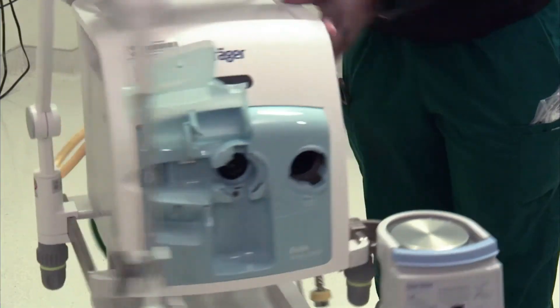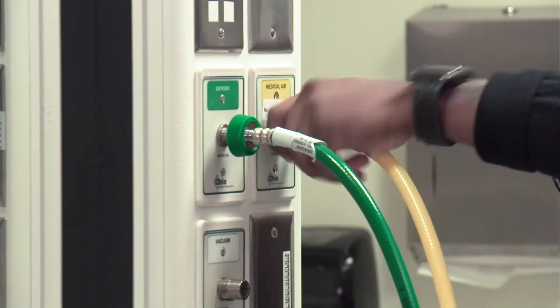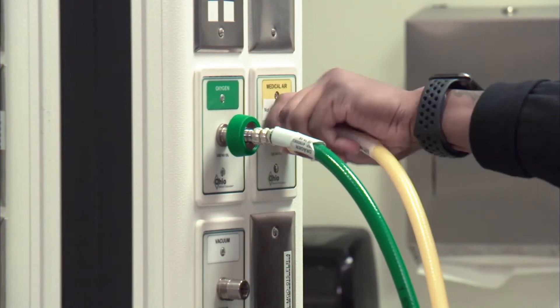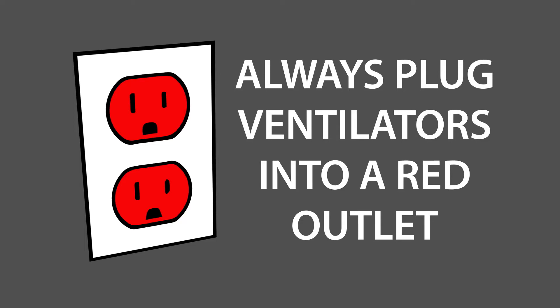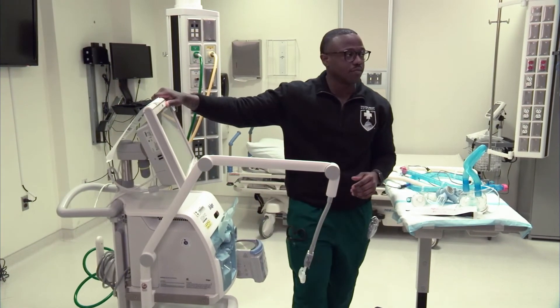On the back of the ventilator, we have our 50 PSI air oxygen sources. The power plugs on the ventilator should go to a red outlet. Once you're done moving your ventilator, always ensure that you lock the vent wheels at the bottom.